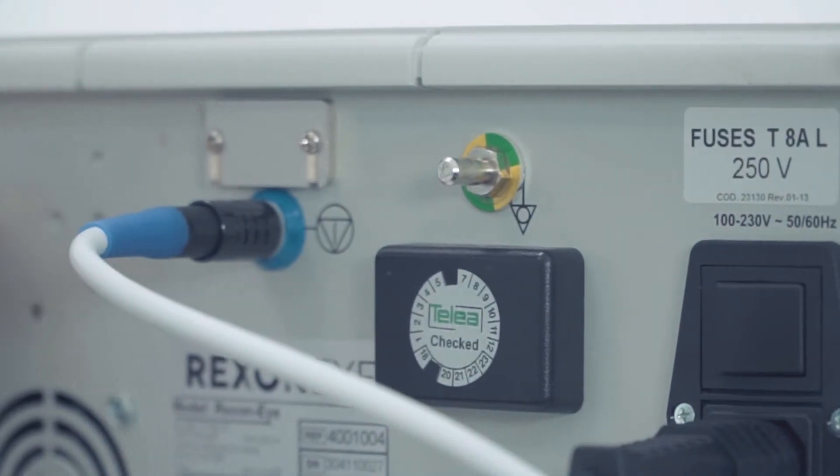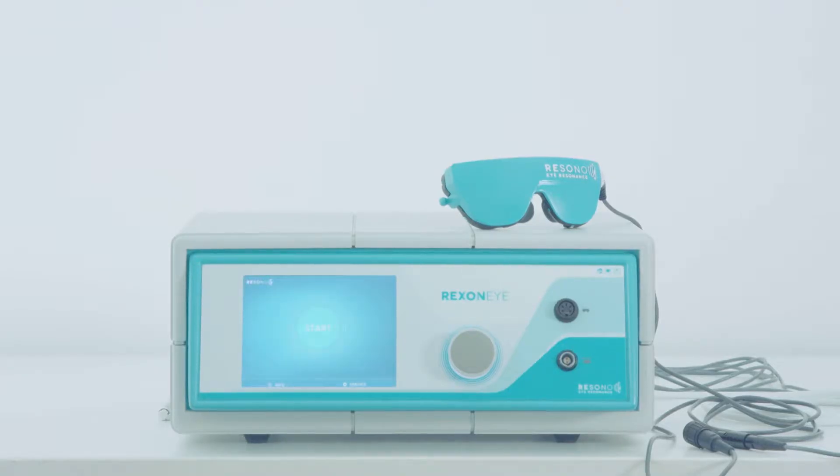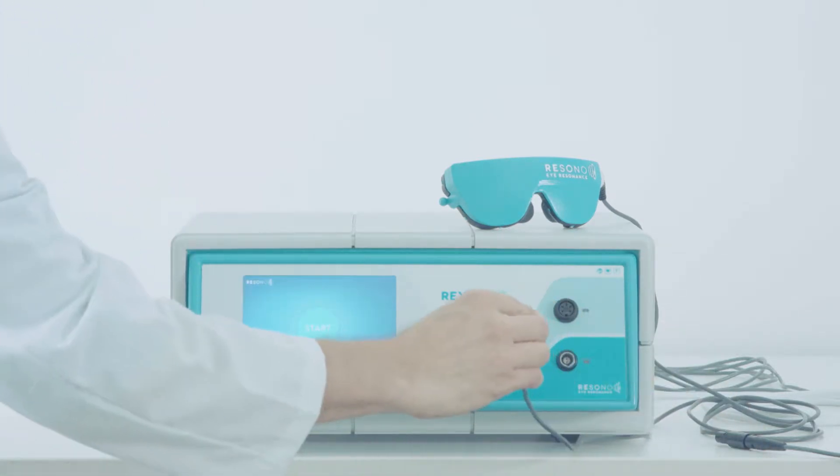Adjust the volume with the knob. Connect the mask cable to the top socket on the front panel on the device.